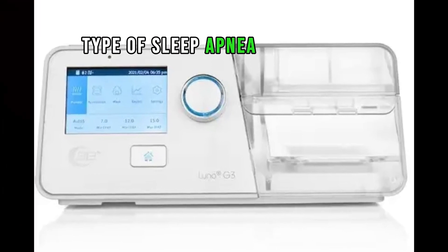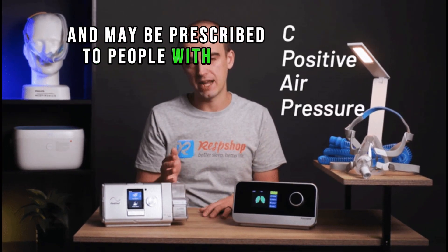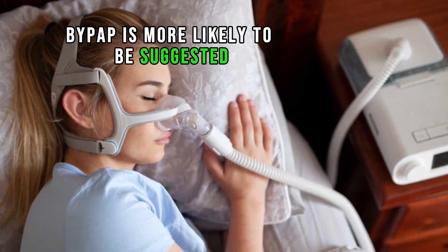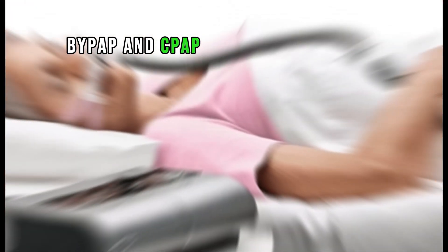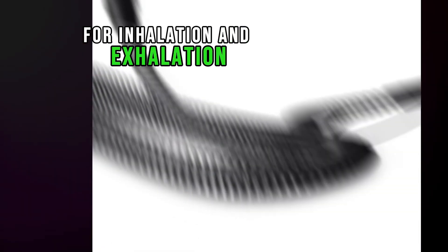Types of sleep apnea: CPAP is typically used to treat most cases of obstructive sleep apnea and may be prescribed to people with mild central sleep apnea. BiPAP is more likely to be suggested for those with CSA and other serious breathing conditions. BiPAP and CPAP devices differ primarily in their air pressure delivery — BiPAPs provide distinct air pressure levels for inhalation and exhalation, whereas CPAPs maintain a constant fixed pressure throughout each breath.